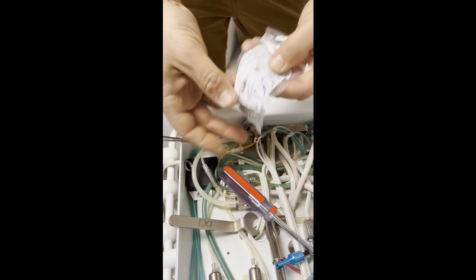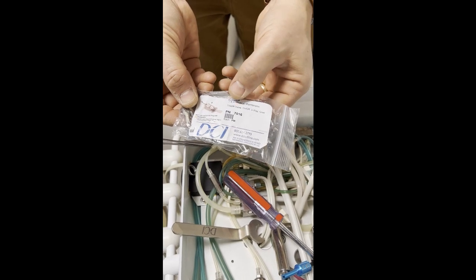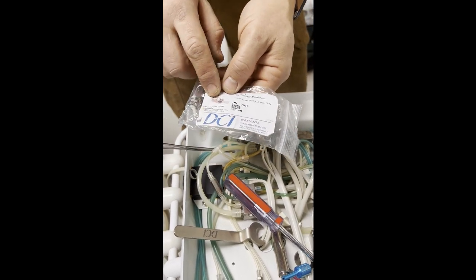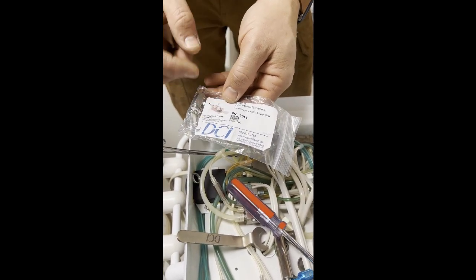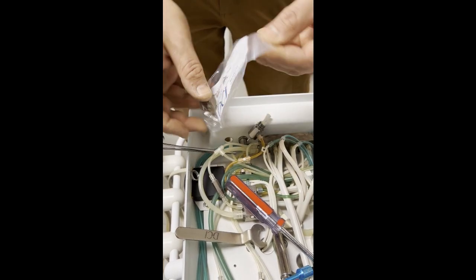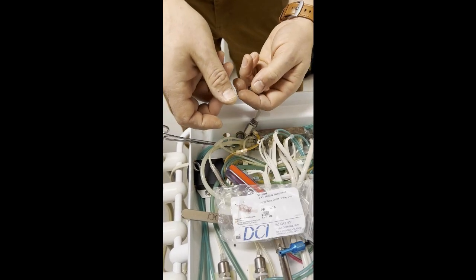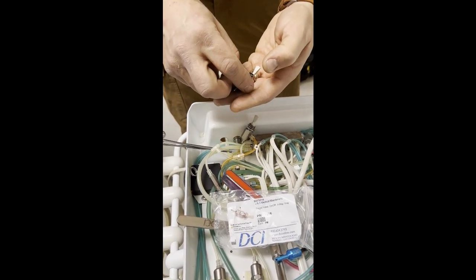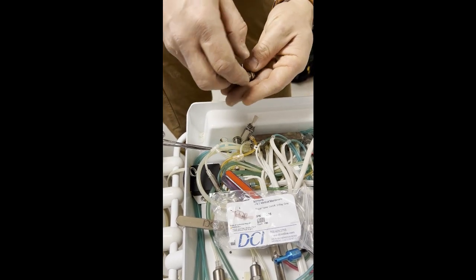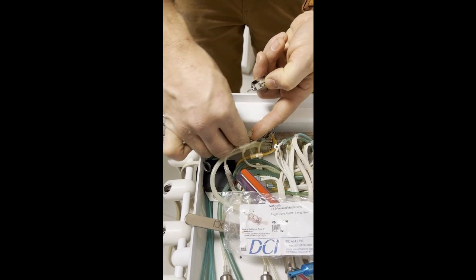Then I'm going to get a DCI part number 7016. This is a 3-way valve. This relieves pressure. The reason you use a 3-way valve is because in the off position, it vents the pressure out. I'm sure this is the right one. You know, we could have a leak somewhere else, but that's okay. We're just going to go with this because this is step 1.